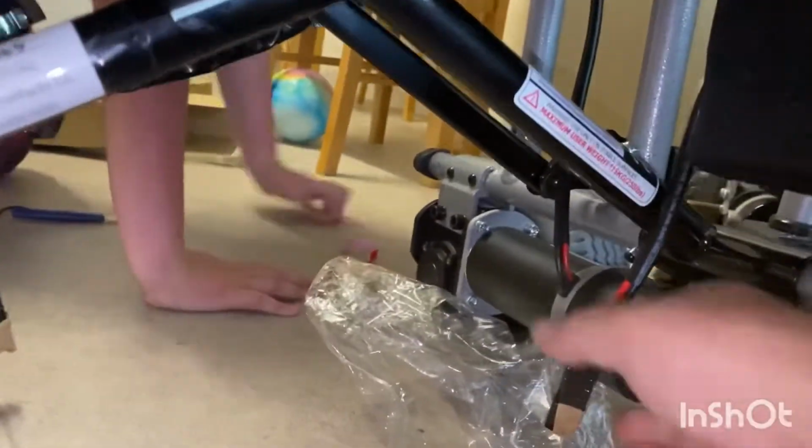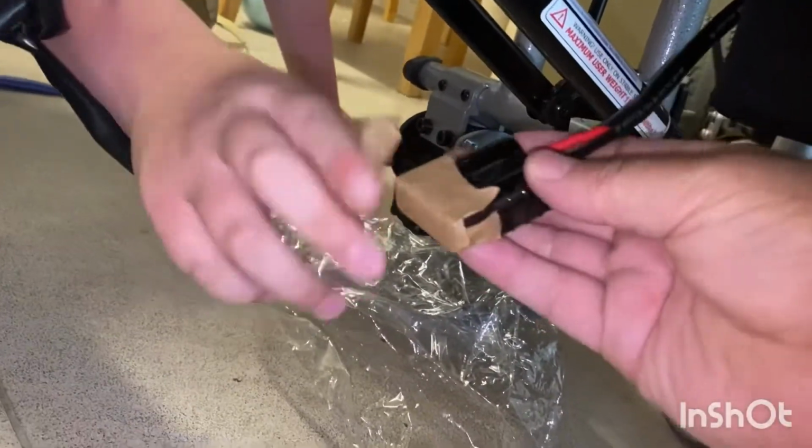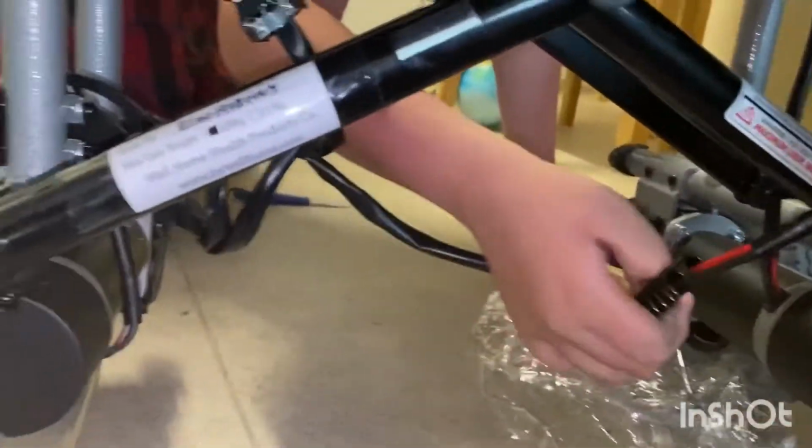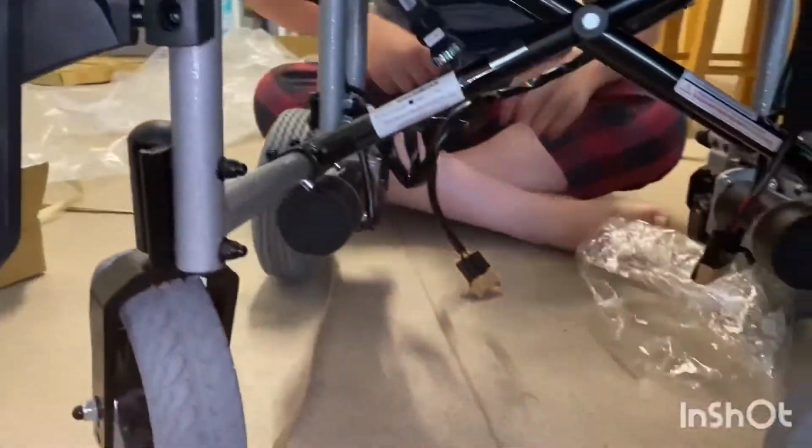After this we are getting ready for plug-in, the plug-in and battery too. We're trying to plug the battery into the two wheels, and also to the control center where my dad can press buttons and they do things like move around.